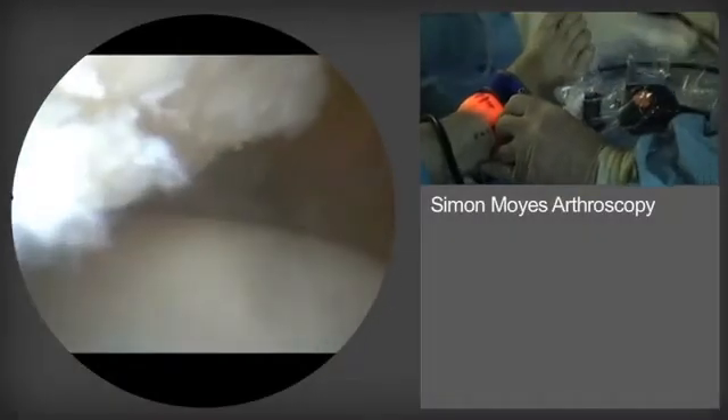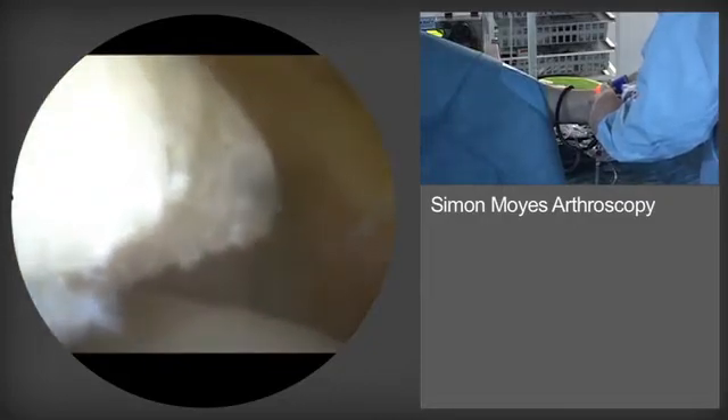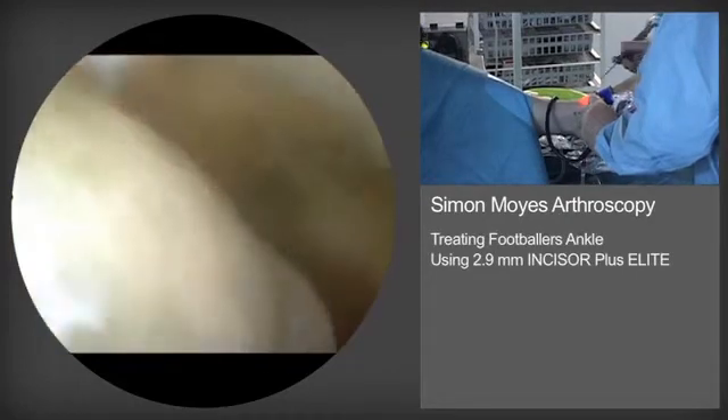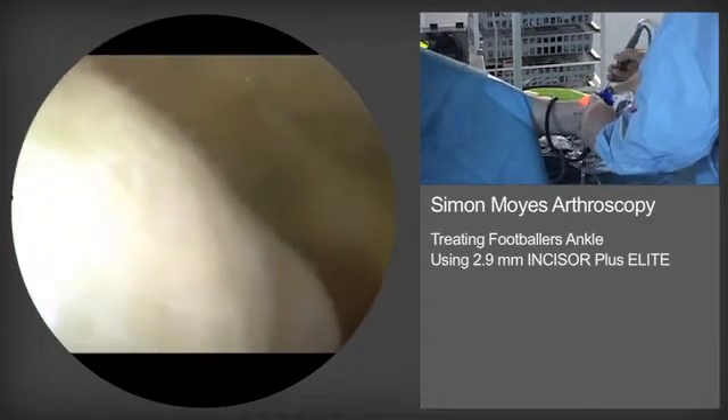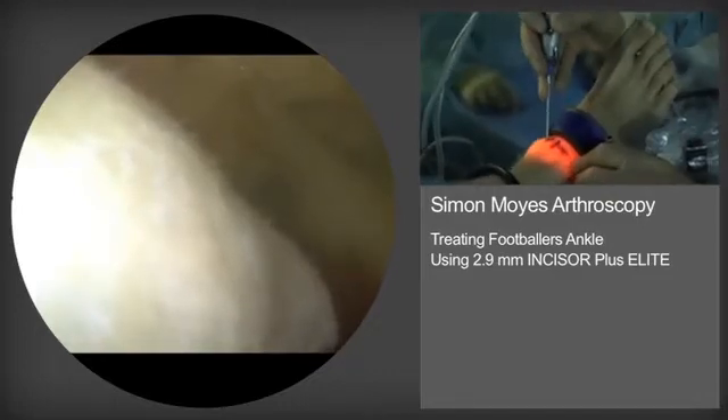Here an obvious tibial spur is now being exposed. We have finished at this point initially with the soft tissue resectors and are about to introduce a burr which will remove the bony element of the tibial spur, as you can see on the left-hand screen.